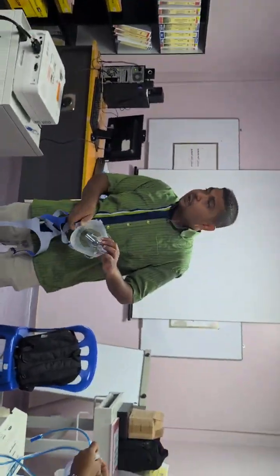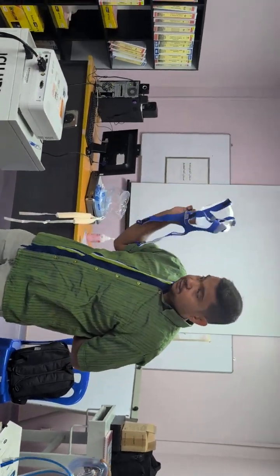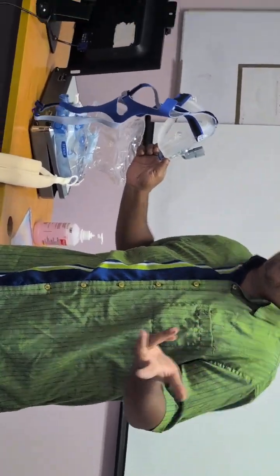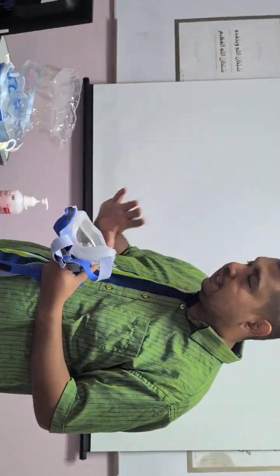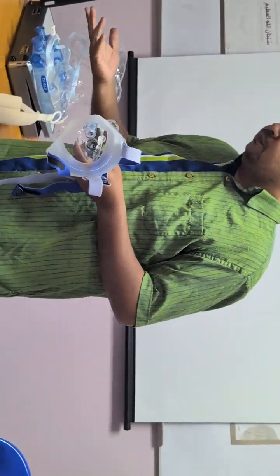Okay. So before I go on to invasive, I'm still in non-invasive. So doctors, I have been carrying this for the past 7-8 years, but I didn't promote it until this year. The reason is this. I do not want to compete with Respironic. Why do I want to compete with Respironic? I'm not going to win. But Respironic now has a global issue whereby they cannot supply. They have even given letters to the hospital saying that they cannot supply. Hence, I told my guys, okay, let's do this.